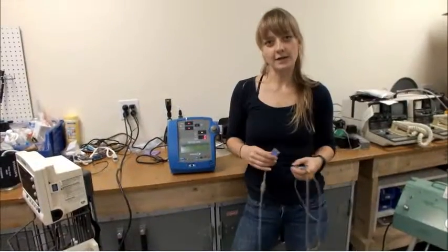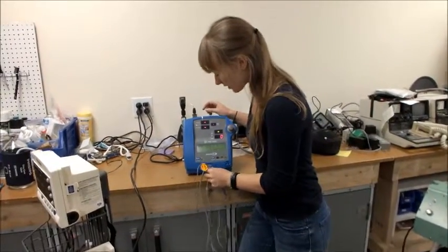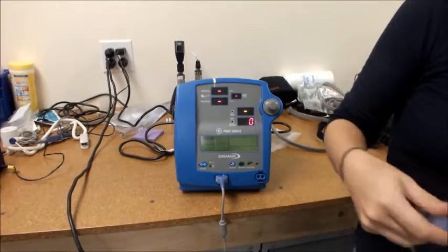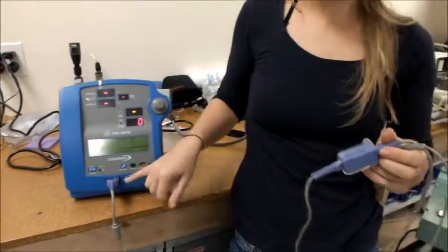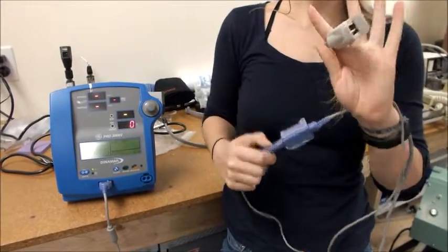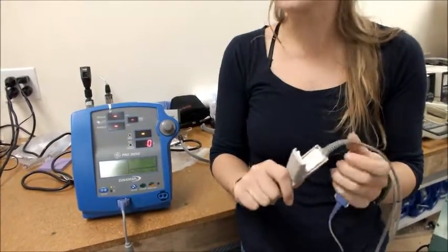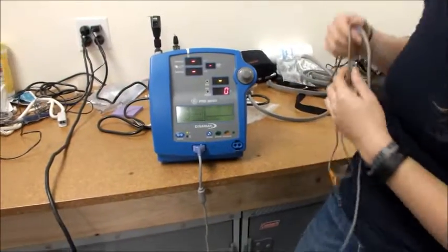Now that we've located all of our different connections, we can attach them to the machine. The SpO2 will click in like that, and as you can see, I have the cord, the connection, and the probe. The probe has a red light on the inside, which means that this connection is working and we can use it to test the machine.